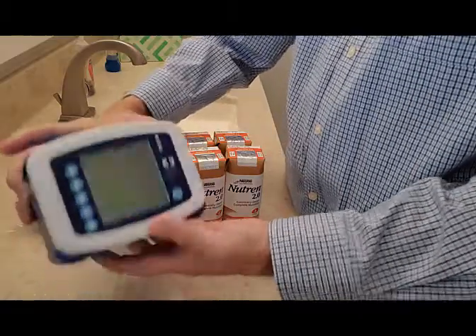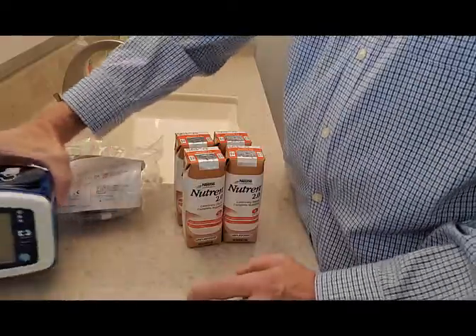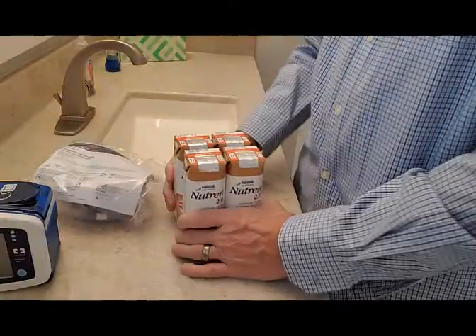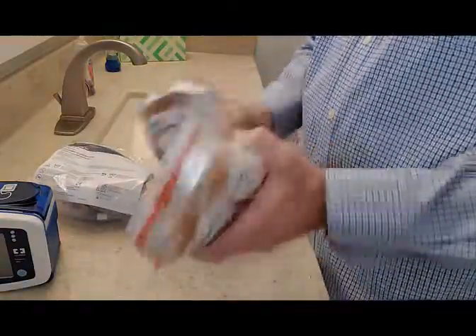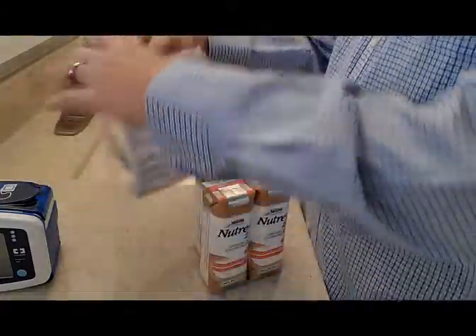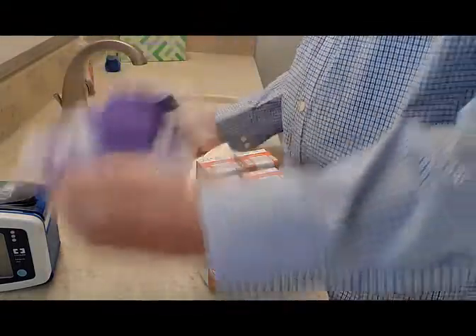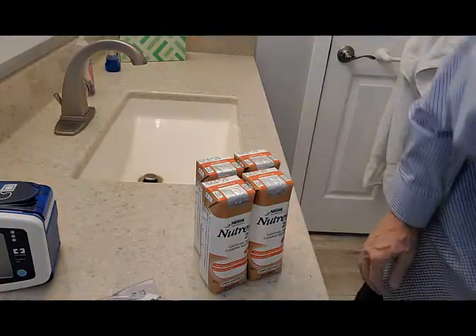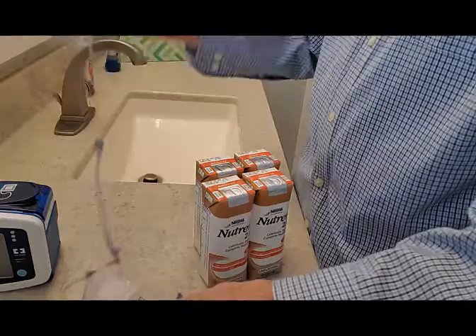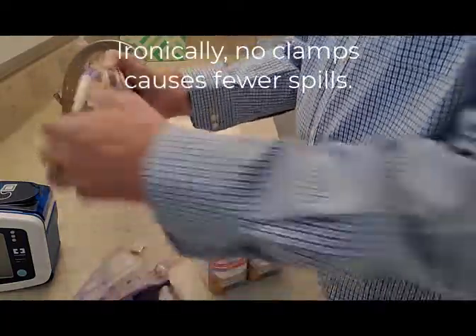I have the Joey Kangaroo. It's not the e-pump, it's the standard one. A little on the heavy side, but not too bad. And I've got my nutrition. Shake well. Always shake well. So first, let's get our bag out. Nice thing about this is there's no clamp anywhere. You don't have to worry about a clamp.